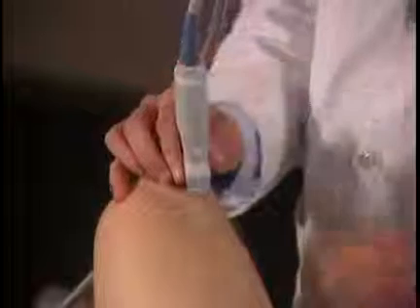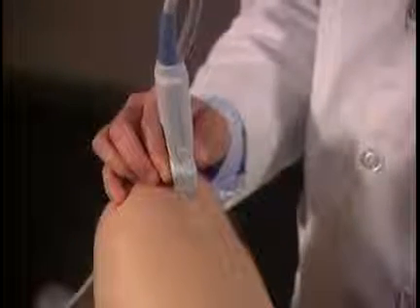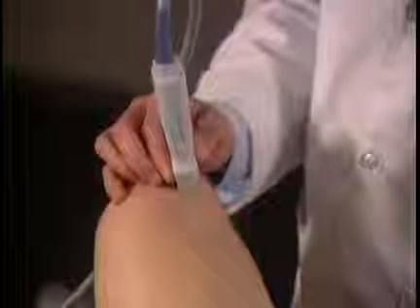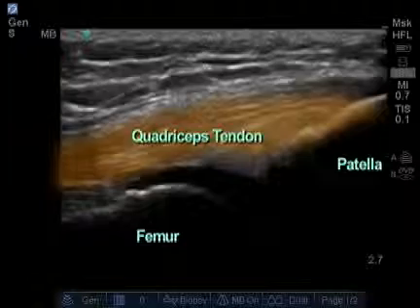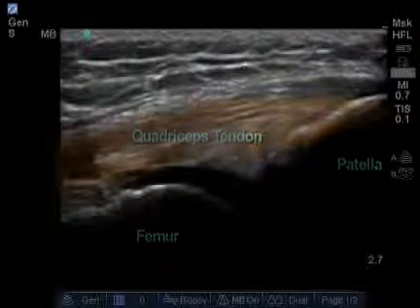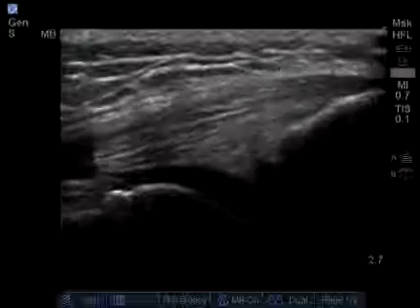It's important to maintain contact on both ends of the transducer to get an accurate image. I'm going to scan up and down the quadricep to detect any abnormality. Clinically, if I suspected a tear more proximally, I would examine further, but for most purposes, this is sufficient.